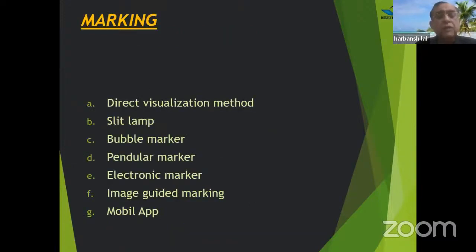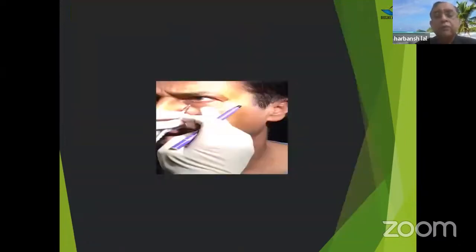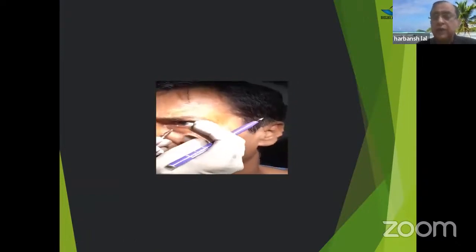There are various methods of marking, but there are studies to prove that there's not much of a difference between one method to another. And as simple as this marking works as well as any other method of marking. I mean, there may be a little bit of a difference, but what is important is, this is our old video, very old video, where we used to mark sitting the patient, and the patient, like a confrontation test, looks straight ahead and then we mark it over there.